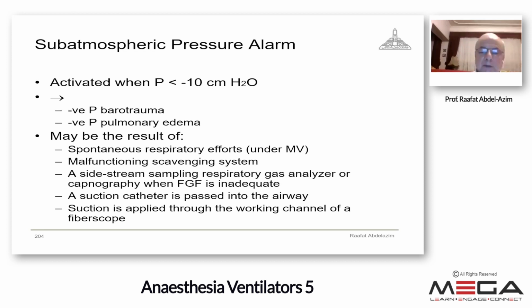If we are going to awaken the patient because the surgery has finished or is near finishing, use manual assisted ventilation. If the patient starts to breathe spontaneously, either give muscle relaxant, or if you intend to awaken the patient, start to use manual ventilation or shift to SIMV, as we will see later, or any form of pressure spontaneous breathing support if it is available, to have the valves functioning for this type of ventilation, with the ventilator allowing the patient to breathe spontaneously.